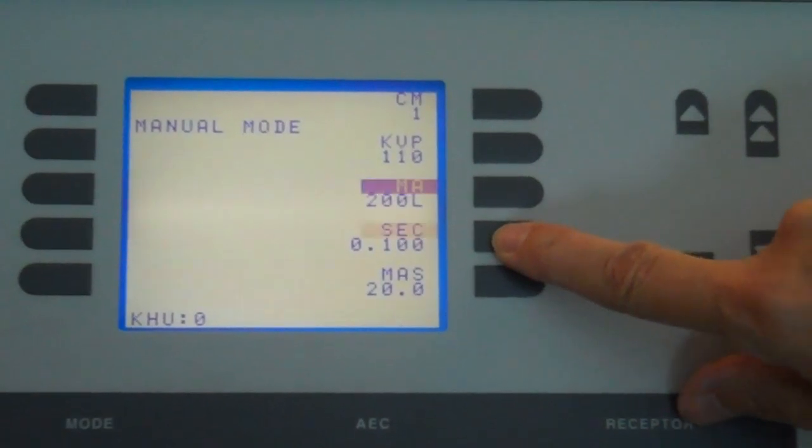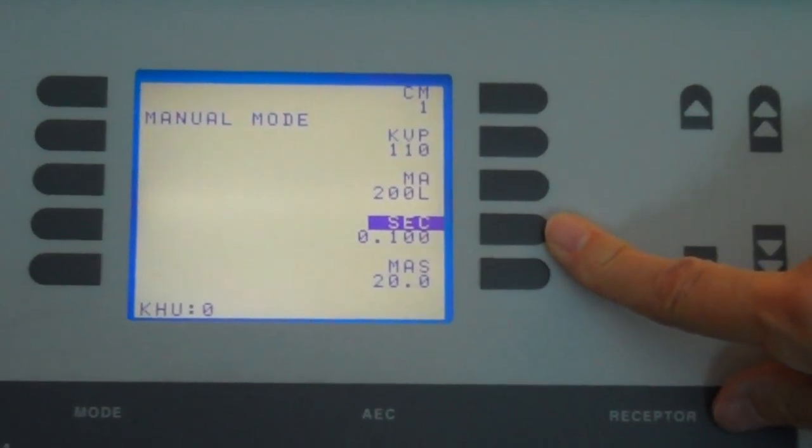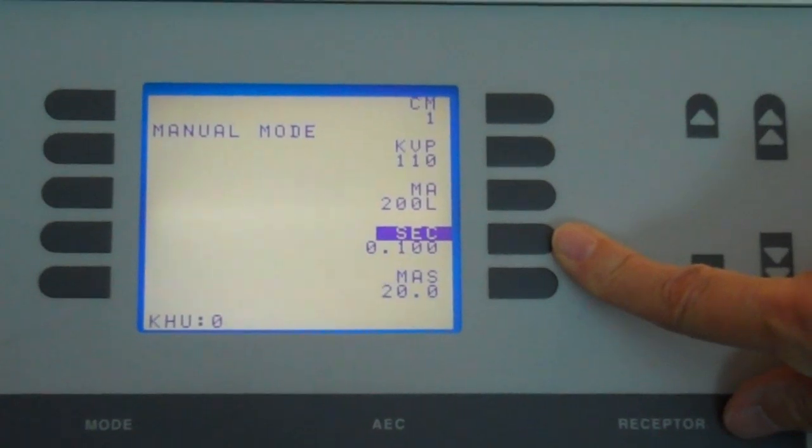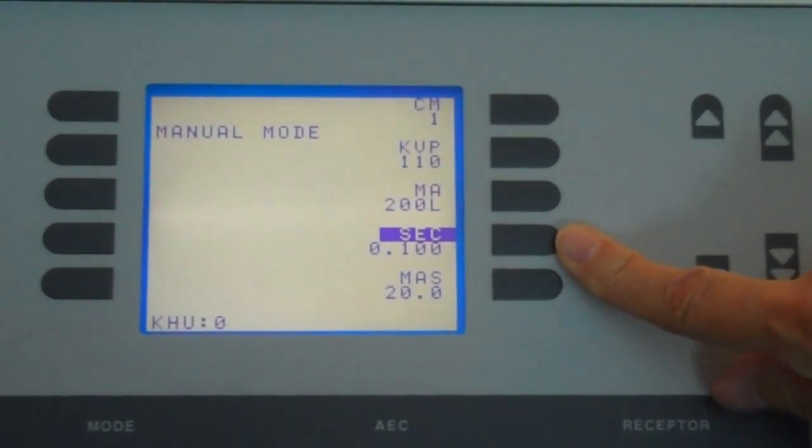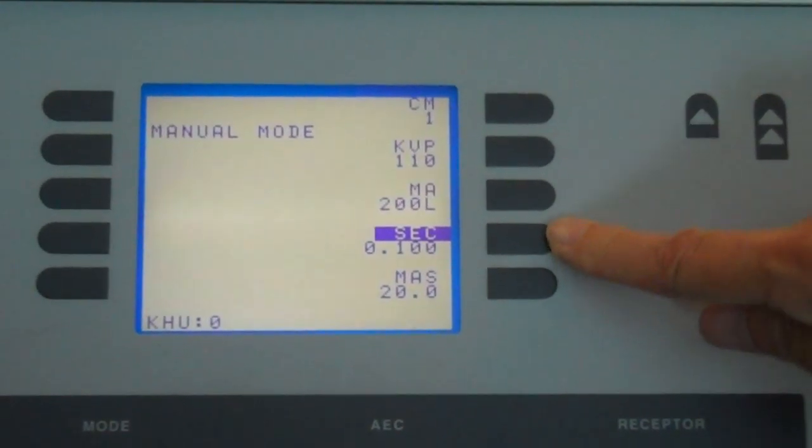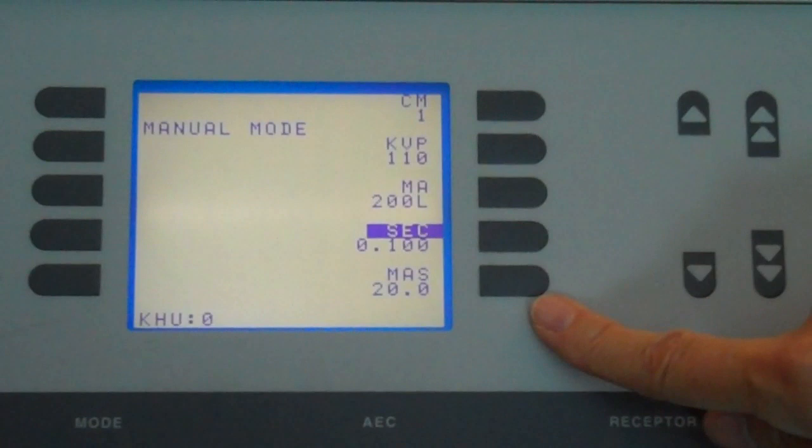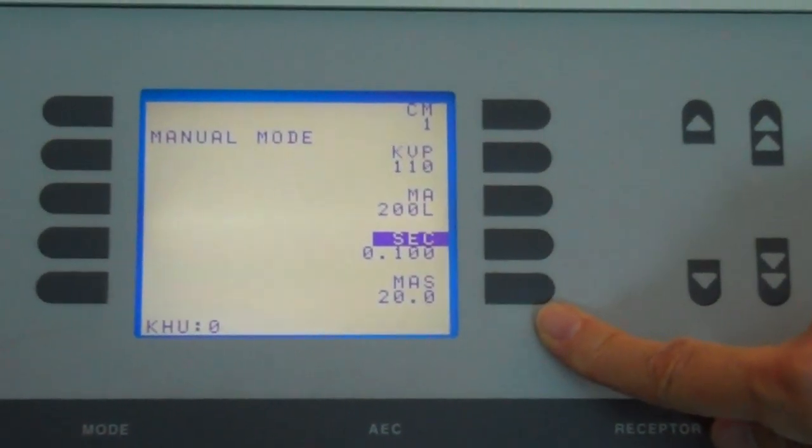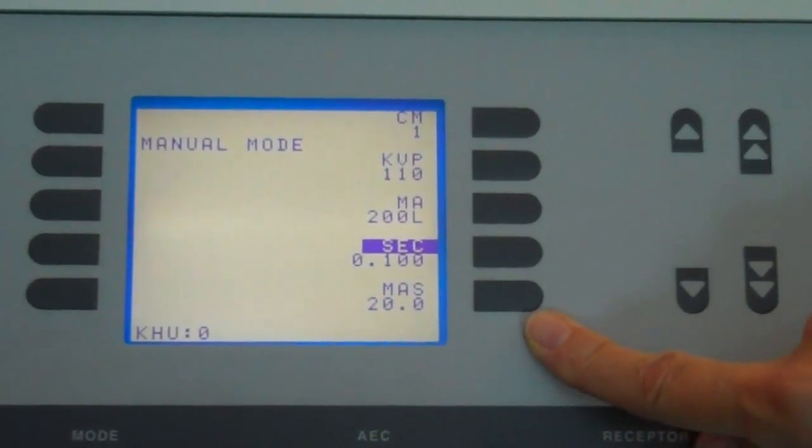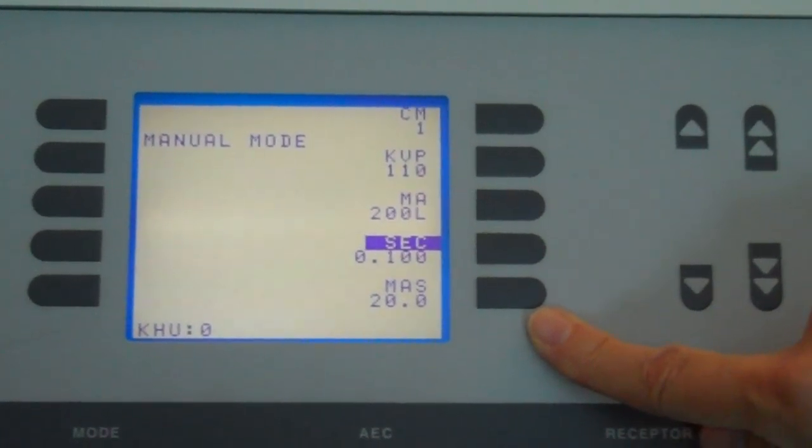Time is the seconds. We want 0.1 second and that is what is currently selected for a total of 20 MAS. All exposures will be taken at this MAS.